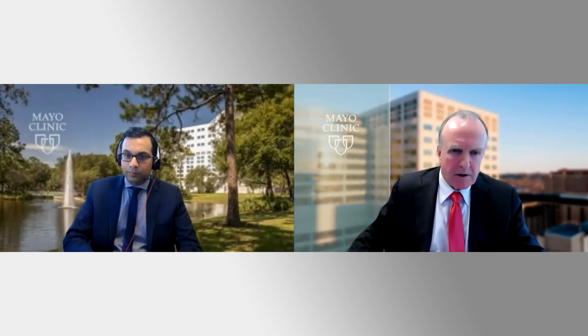and you may not have seen the patient at the initial diagnosis. On the other hand, listening to you, it does seem as though this would still be very, very useful for someone who did see the patient in their own hospital, and is now following them up, months later or a year or so later. Cardiac MR really does seem as though that would be the tool to use. Would you agree with that? And probably prefer it over CT, perhaps, if you had to make a choice.